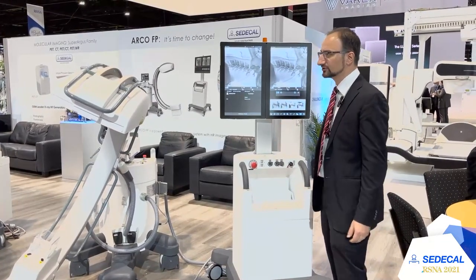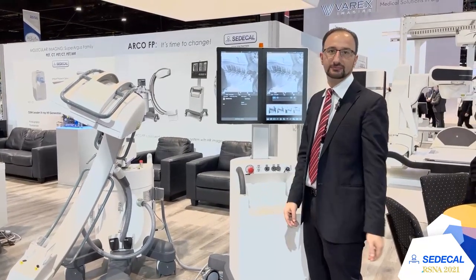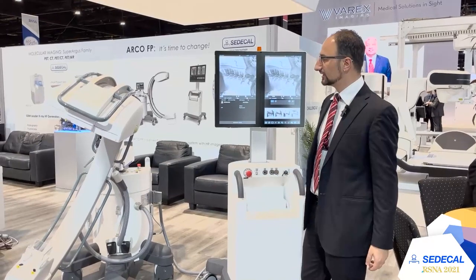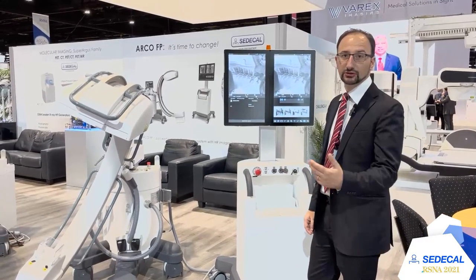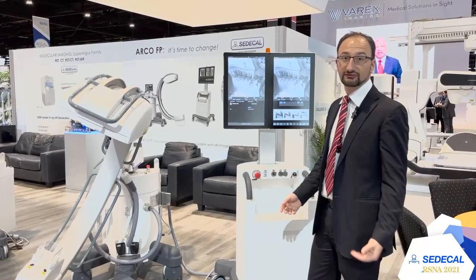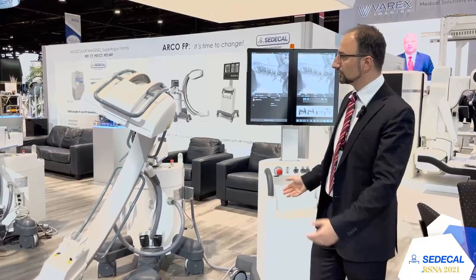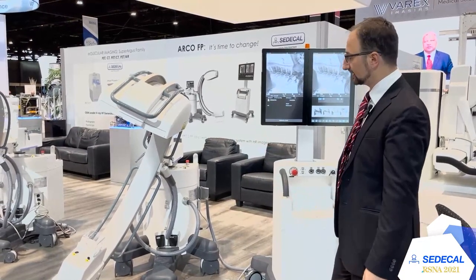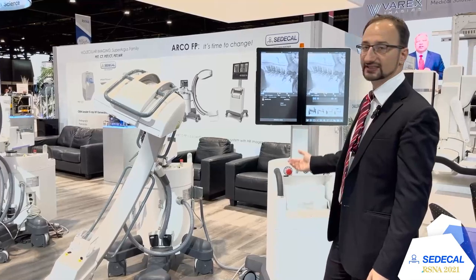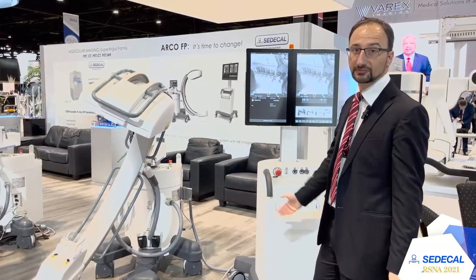With this C-Arm it's possible to do every surgical operation like prosthesis, plate removing, screws, ERCP procedures, and urology procedures. We also have the DSA package for vascular treatment, so it's a C-Arm where you can do everything. The power of the system allows it to handle every kind of examination, even on larger patients.